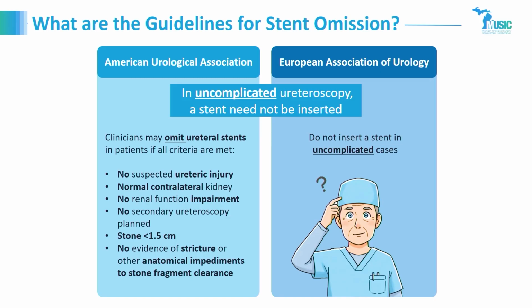Despite there being some guidance and some criteria, the reality is that many urologists, especially in the US, routinely stent around 80% of patients after ureteroscopy. So why? Why do urologists continue to stent, despite guidelines saying it's okay not to?